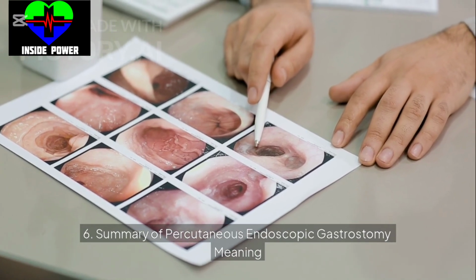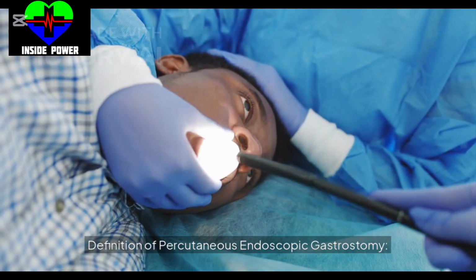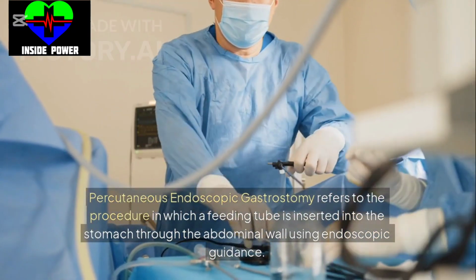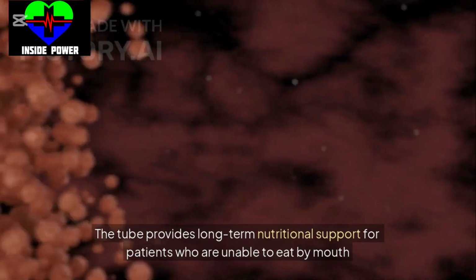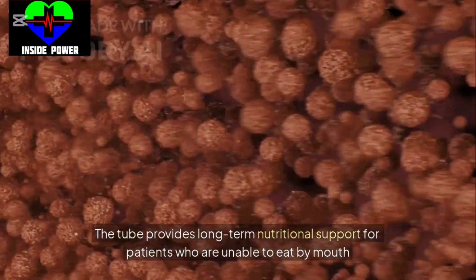6. Summary of percutaneous endoscopic gastrostomy meaning. Definition of percutaneous endoscopic gastrostomy. Percutaneous endoscopic gastrostomy refers to the procedure in which a feeding tube is inserted into the stomach through the abdominal wall using endoscopic guidance. The tube provides long-term nutritional support for patients who are unable to eat.